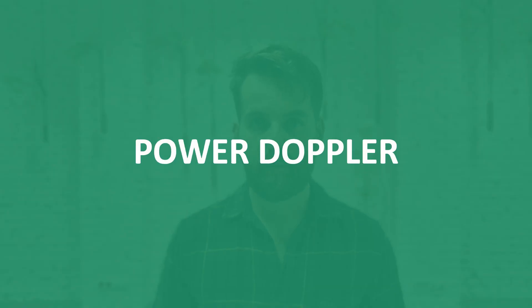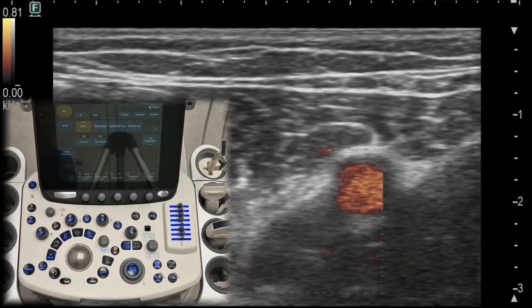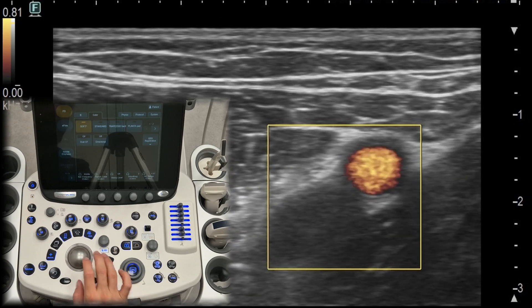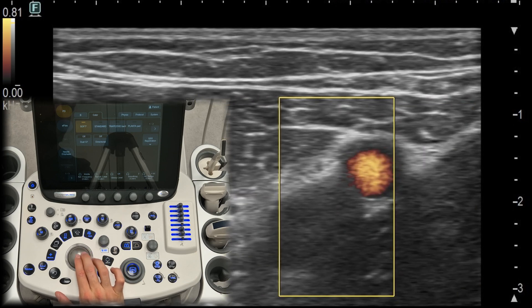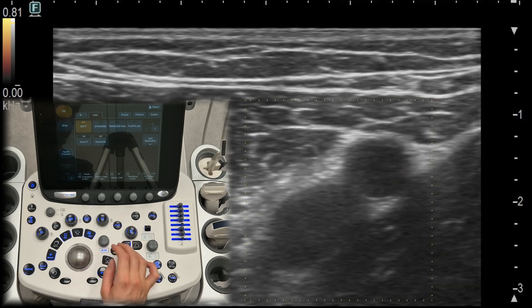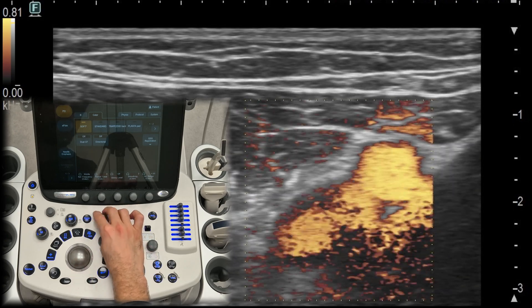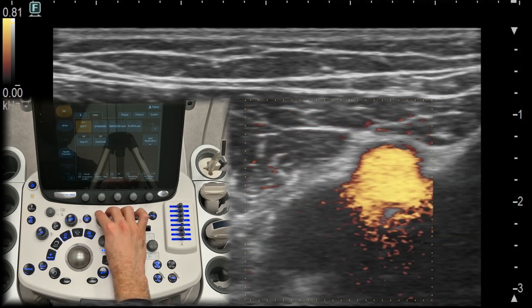Power Doppler. Power Doppler is another tool for visualizing blood flow, but it is more sensitive than color Doppler and can detect even small amounts of slow-moving blood. This makes it ideal for examining areas with subtle blood flow like tendon inflammation. You can increase or decrease the power Doppler sensitivity by turning the button right or left.